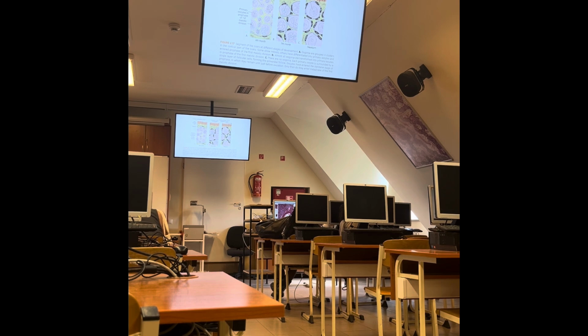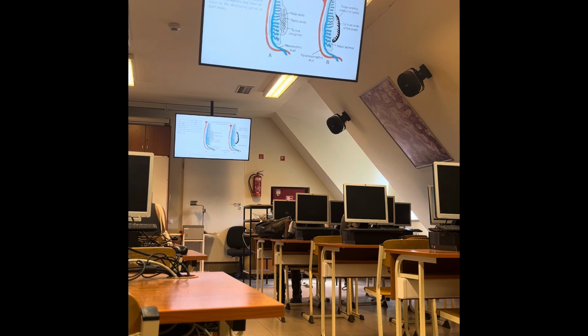So in the first months they form groups and they divide by mitotic divisions. In 7 months, these cells are mostly primary oocytes surrounded by the follicular cells, and then this is the newborn situation. And also on the surface we can still see the surface epithelium that is also visible on the specimen. If you remember, on the surface of the ovary we find cuboidal epithelium. Sometimes it is flattened, but officially it is a cuboidal epithelial lining.